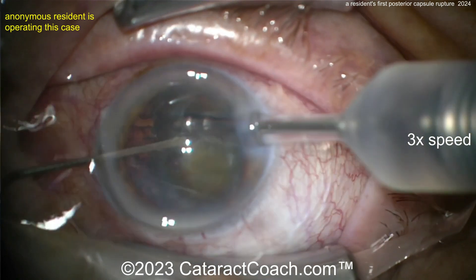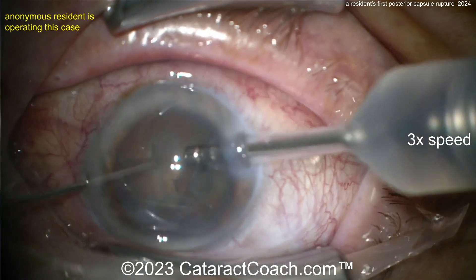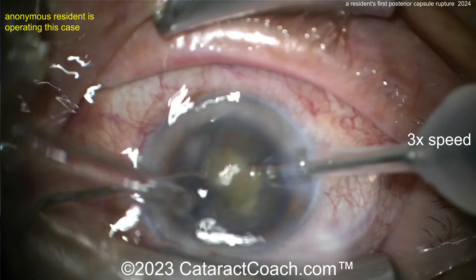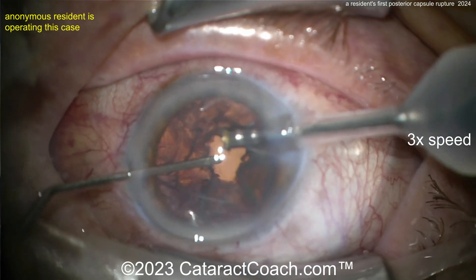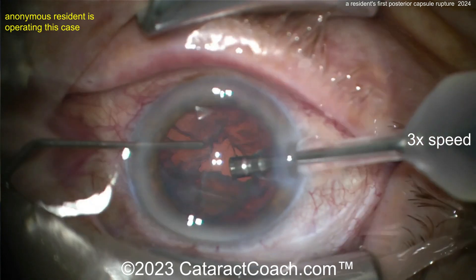It looks like a spatula in the left hand and a phaco probe in the right hand, getting the nuclear pieces up out of the capsular bag and emulsifying them. That looks pretty good so far — but wait, what just happened? They weren't protecting the posterior capsule. There's a fluidic imbalance there.